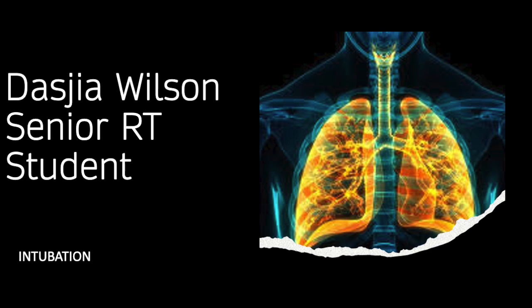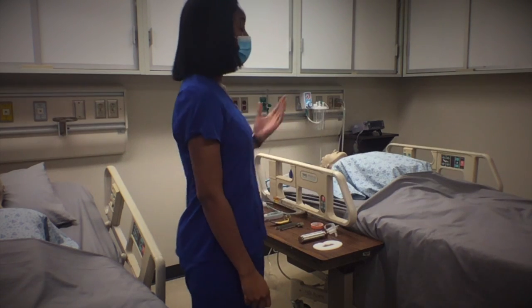Hi, my name is Dasjia RT, and I am a respiratory care student at Baptist Health Science University. Today we will be intubating this patient.